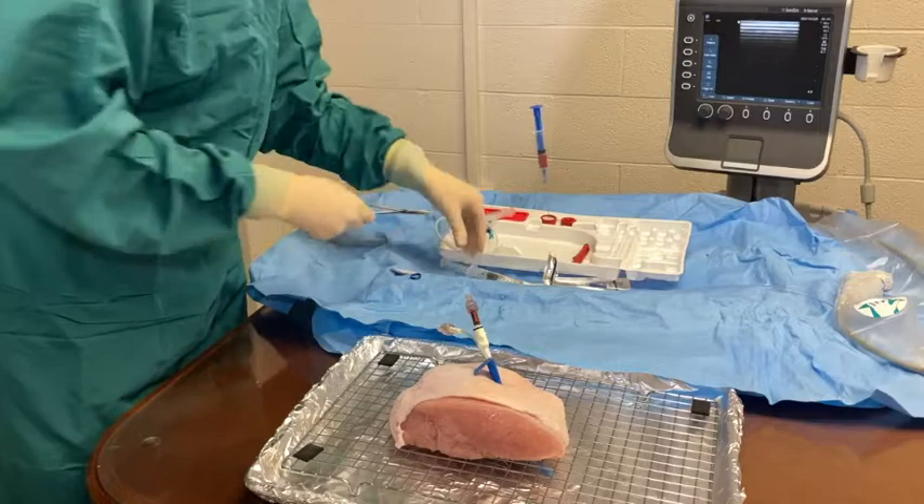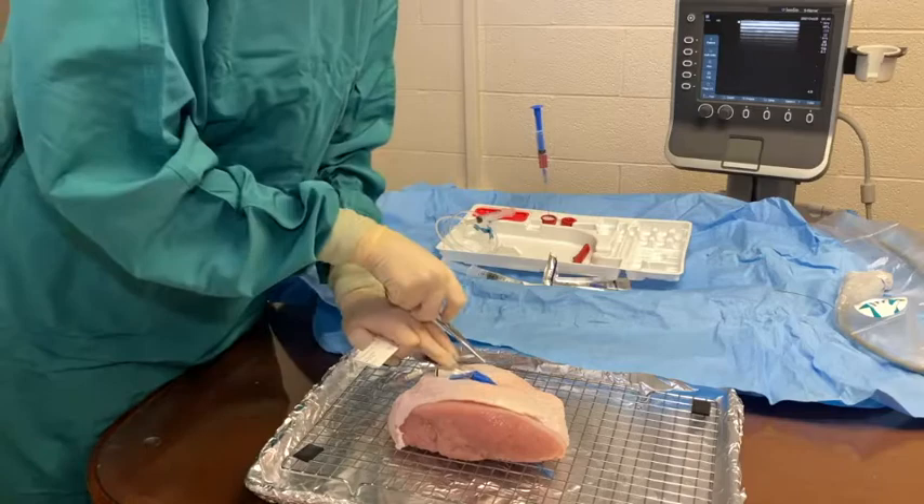Lastly, you will suture the MAC introducer into place. Sutures go on the blue portion of the MAC.